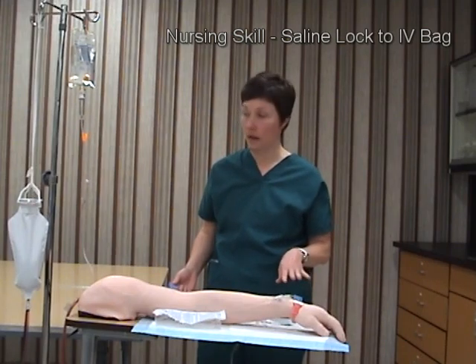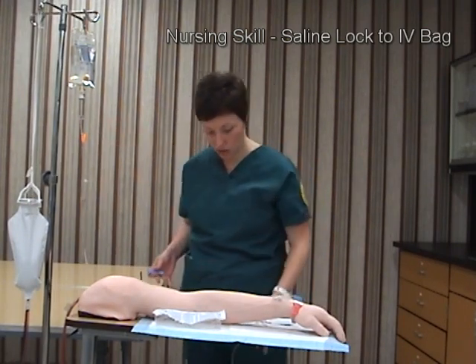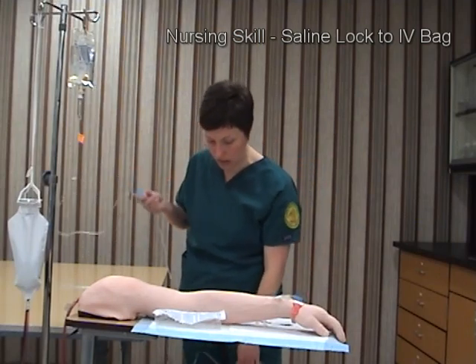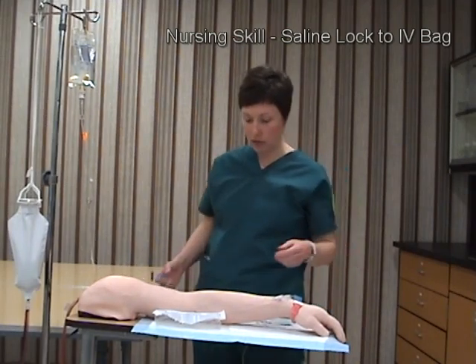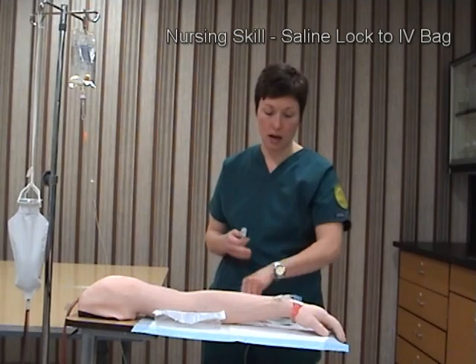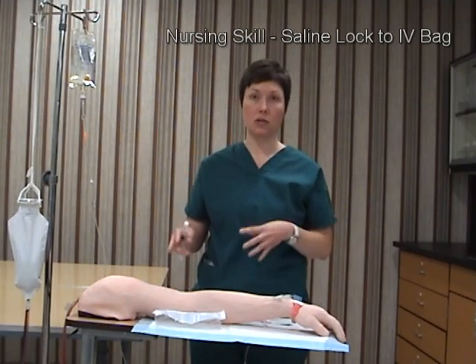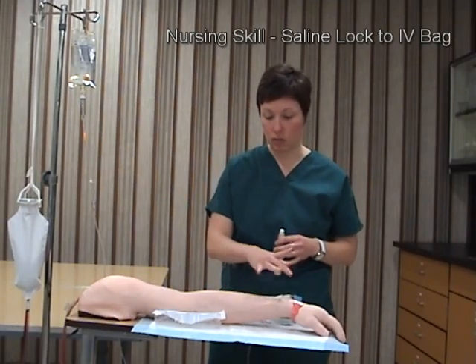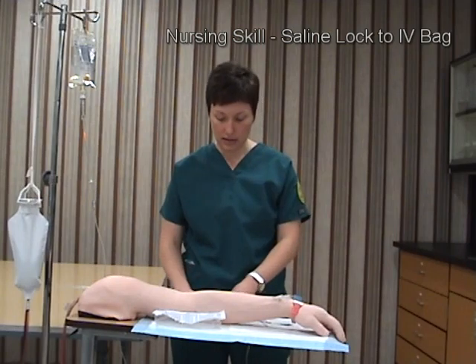I'm just ensuring that the line is freely flowing and I want to follow it down to make sure there are no occlusions. I'll monitor the patient's tolerance to the procedure. When I am done, I will document everything, including the patient's tolerance and any redness or abnormal findings around the IV insertion site.